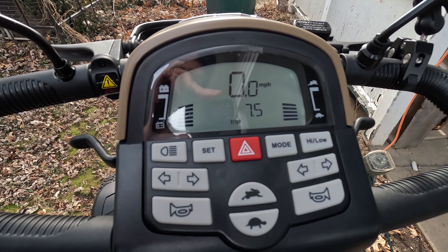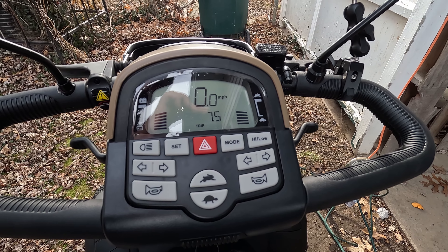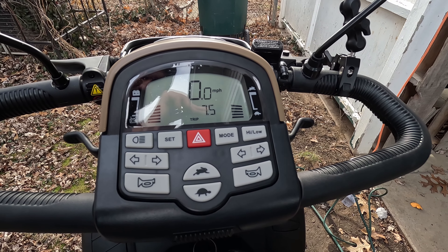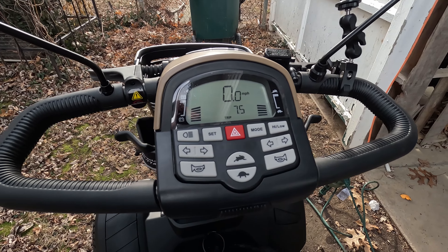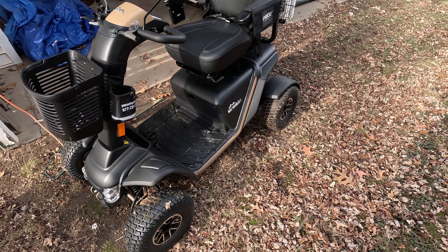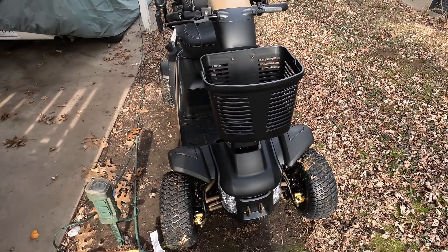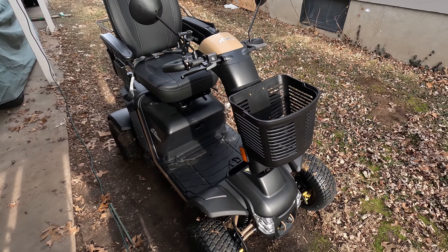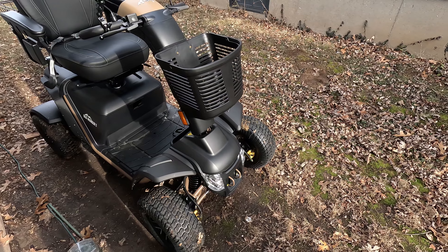Interesting — after sitting for a bit, the battery went back up from two bars to five bars, then six bars. Very interesting. This is now what the scooter looks like — it's not as new looking as it was, but still very nice.